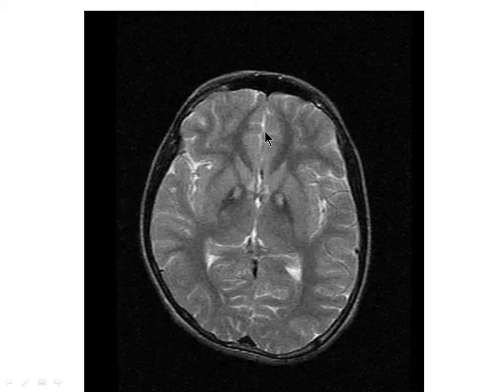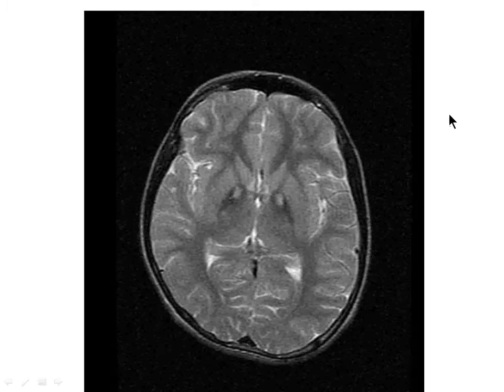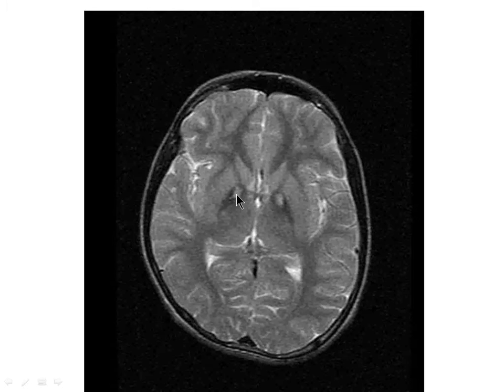Can you see the finding? Can you pick it up anywhere? There is a T2 hyperintense area at the medial part of the globus pallidus which is surrounded by T2 hypointensity bilaterally. There is T2 hyperintensity in the globus pallidus which is surrounded by hypointensity — bilaterally symmetrical. What do you think this is?